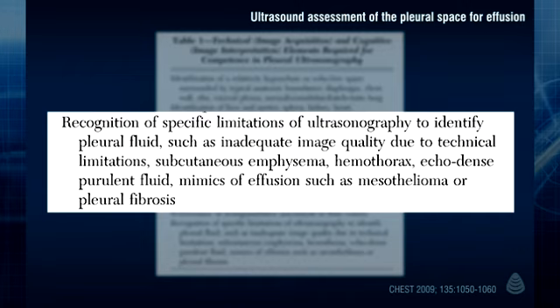Recognition of specific limitations of ultrasonography to identify pleural fluid, such as inadequate image quality due to technical limitation, subcutaneous emphysema, hemothorax, echo-dense purulent fluid, and mimics of effusion such as mesothelioma or pleural fibrosis.